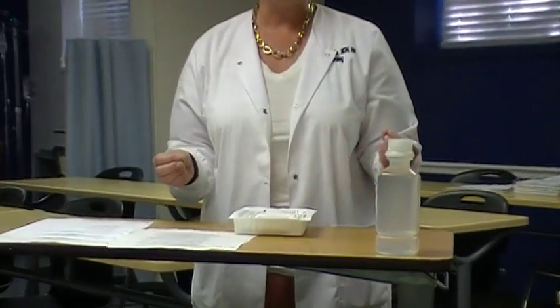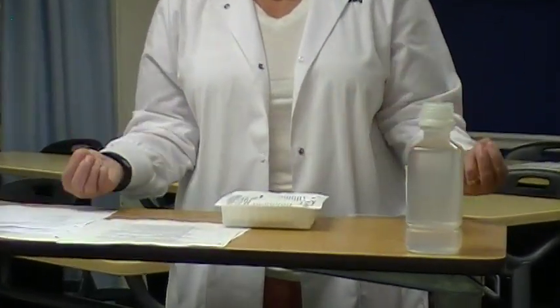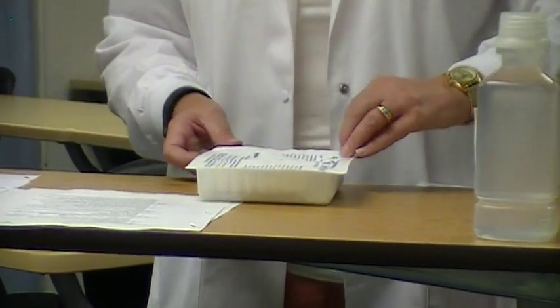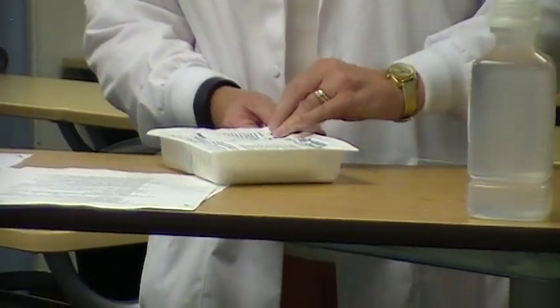The next thing that we're going to do is take our sterile tray and open it. When you open a tray or a package, you always open away from you first. Then if it has more of a package, you're going to open the sides, and then you're going to open the side that's closest to you. So I'm going to open it away from me.